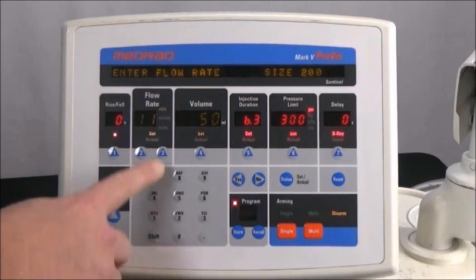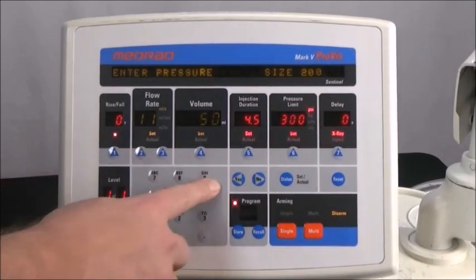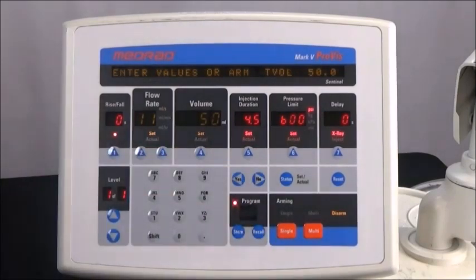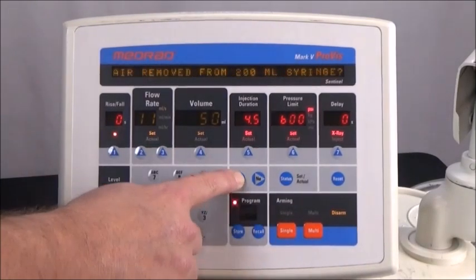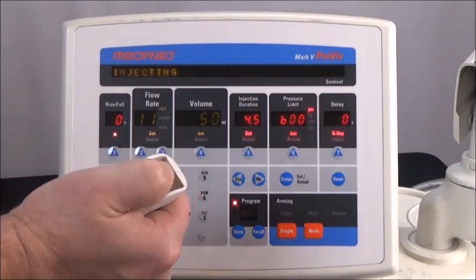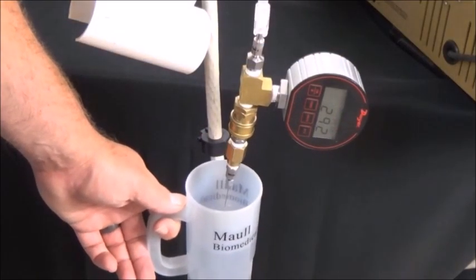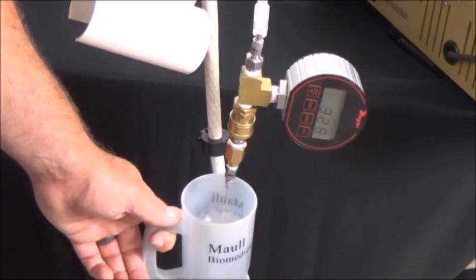Change the flow rate to 11 milliliters per second and the pressure limit to 600 psi. Single arm the injector and inject, allowing the full injection to complete. Shoot the injection directly into a container, being careful not to bend the needle or let the stream of water hit your hand.